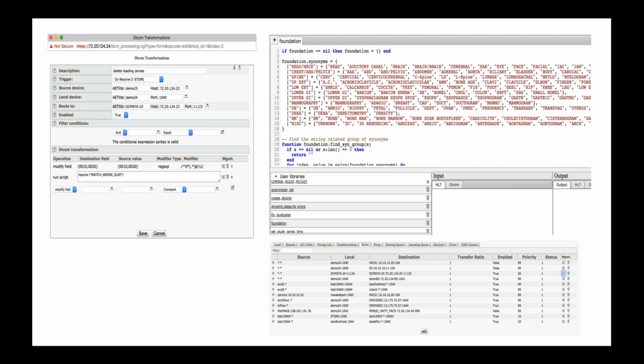And this becomes a challenge, especially when you're moving from legacy systems to perhaps Epic or Cerner or some new platform, and you have a mismatch in MRN. So for Foundation, we'd like to have those two things consistent in our platform. So what we do is we apply a rule like this one that basically says delete all leading zeros when it's from a certain place. And it's basic regular expressions. You guys can all see the DICOM header field there that we're modifying, and that's it.